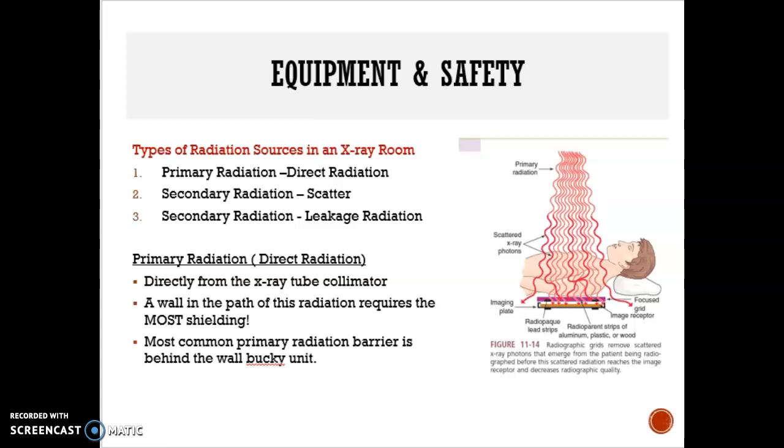And shielding must be appropriately calculated because you don't know what's beyond that wall. It might be a classroom, it might be a reception area, so shielding must be adequate enough to protect those in the adjacent room.